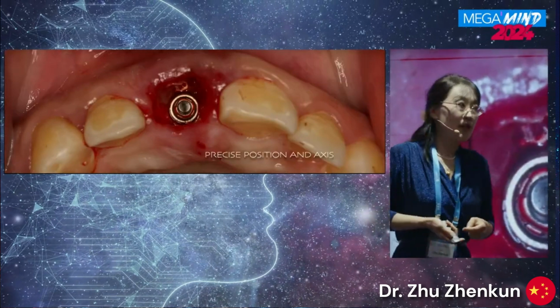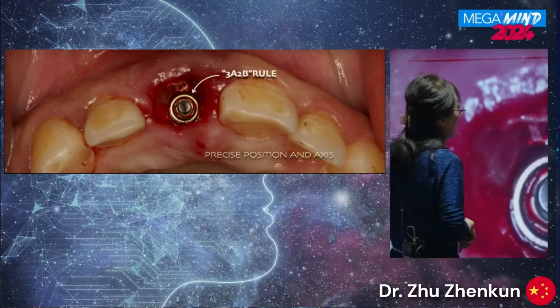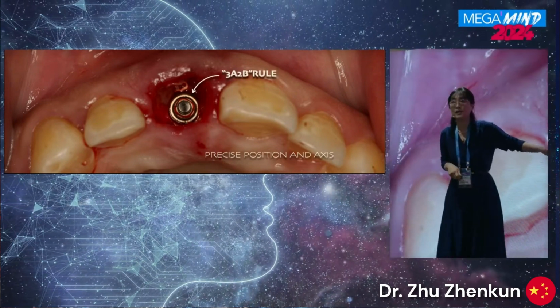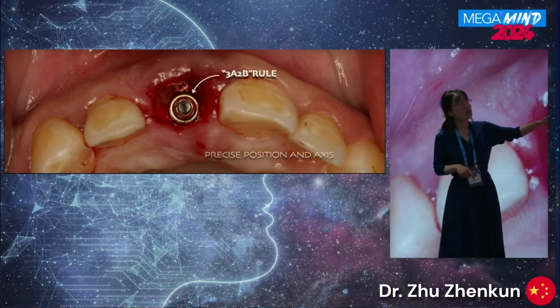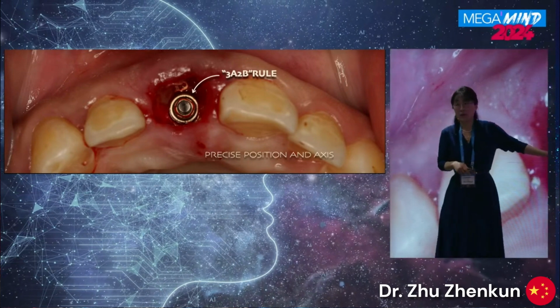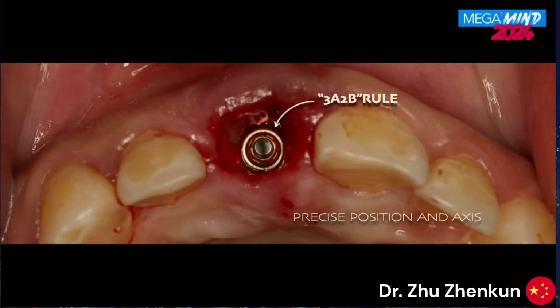Once the tooth had been extracted, according to the 3A, 2B rules, we know that the implant should be placed 3 millimeters apical and 2 millimeters in the palatal position to ensure the implant is positioned in a correct way. And in this case, the implant is placed with a high torque.